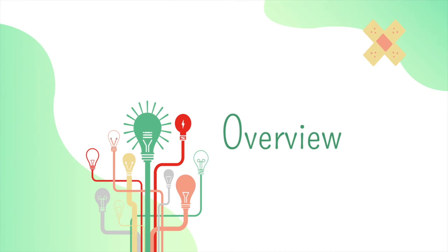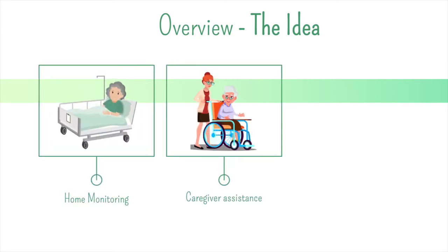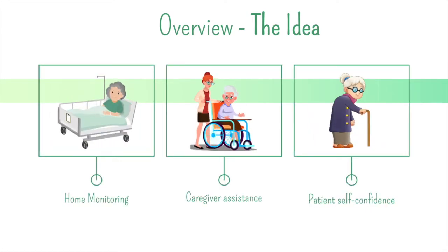The project consists in an IoT platform that provides monitoring tools to be always present for your patient. It wants to help you in your job as a doctor, as a caregiver, and above all, it wants to increase your confidence as a patient.